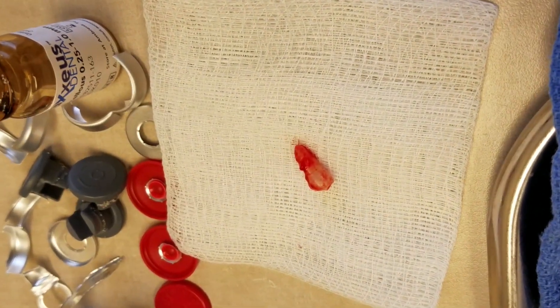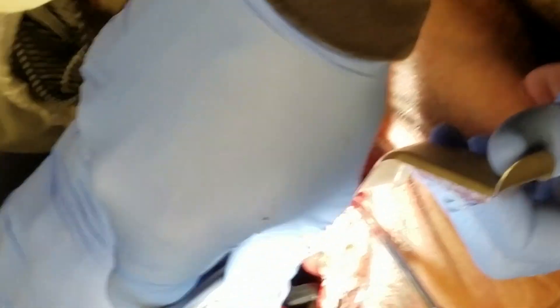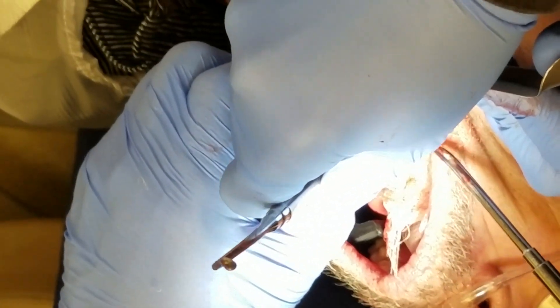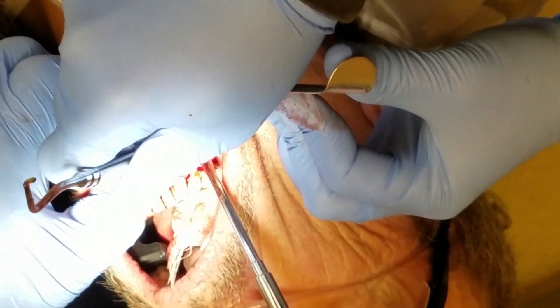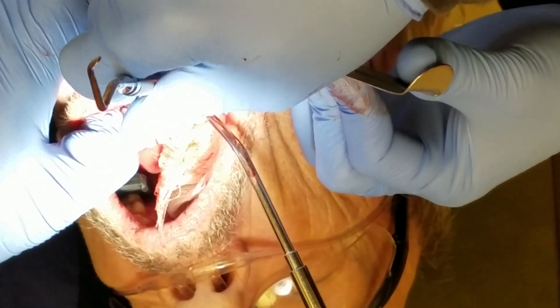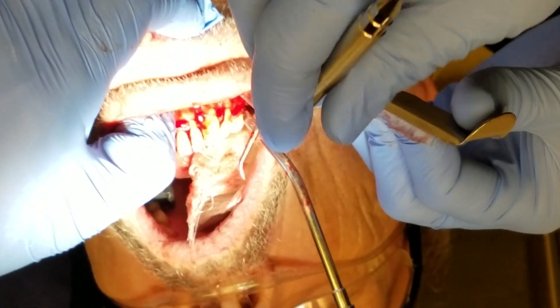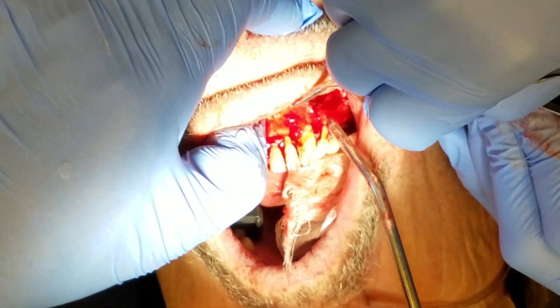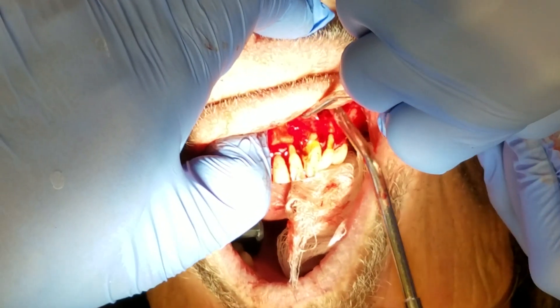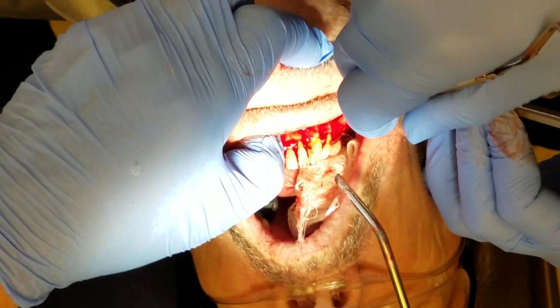The lighting is always difficult here, but we're trying to show that there's actually a dehiscence in the bone right here that goes back into the sublingual space. This is just a small piece of missing bone. It goes up underneath, and I've made sure we've got all of the soft tissue out of this area. I still need to go down next to the actual neurovascular bundle — there's still some tissue there that we've got to tease away too.